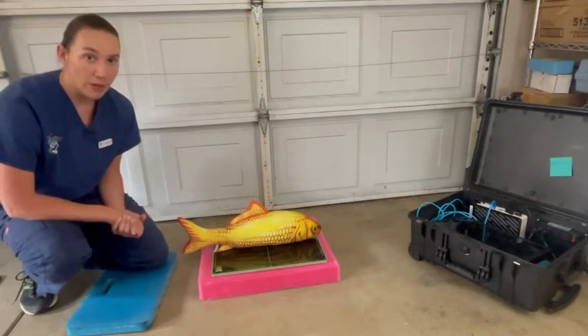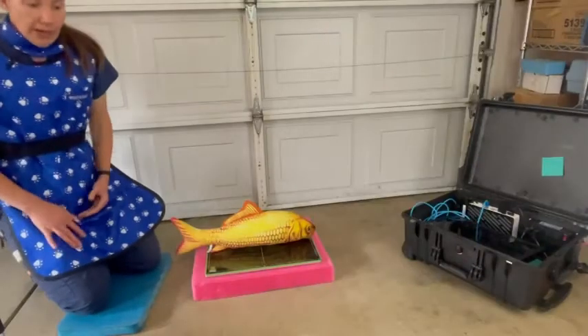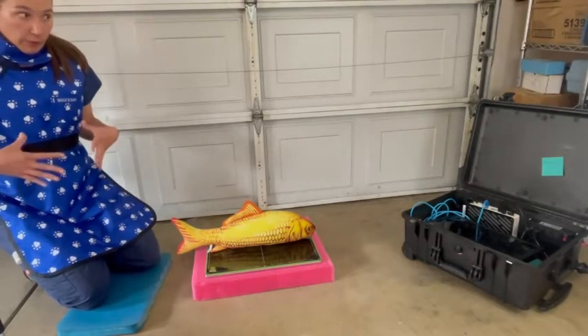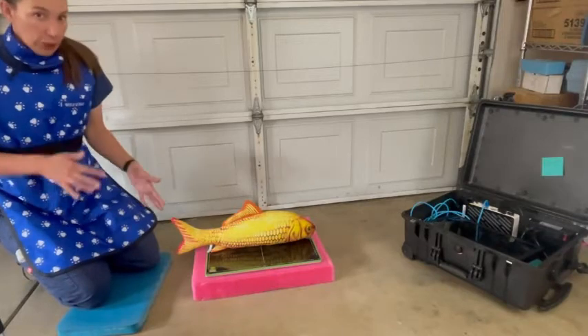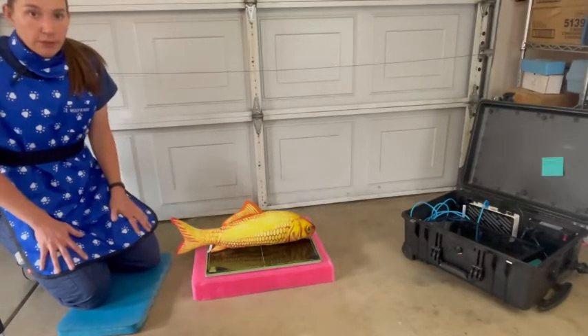So I am now all gowned up in my lead apron. Remember, when you're taking radiographs and working around x-rays, it's really important that you take all the safety precautions that you can. For radiographs, all of our patients are anesthetized.